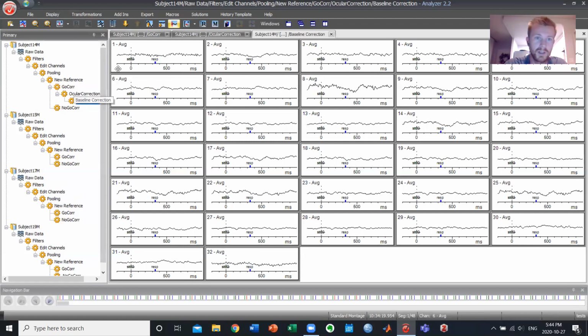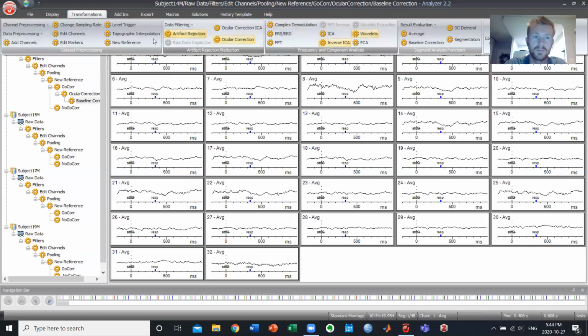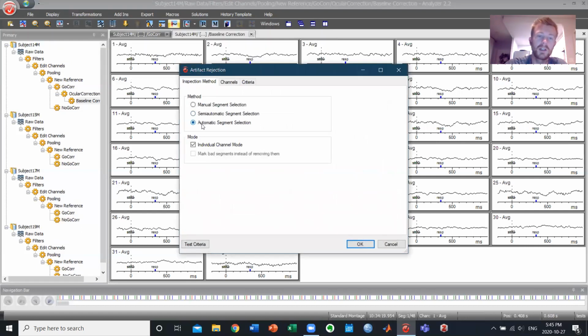So that's all done. I'm going to open that. And now I'm going to do artifact rejection. So I'm going to choose automatic segment selection. They allow you to do it manually to look through all the trials by themselves, but we're just going to do automatic. And we're going to make sure that we're removing the trials instead of just marking them as bad.